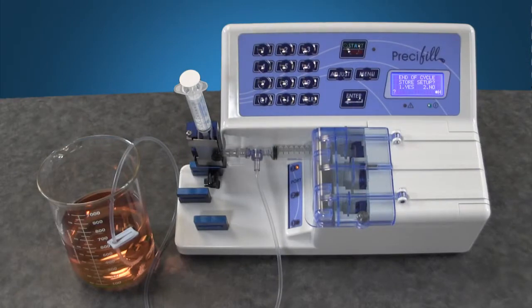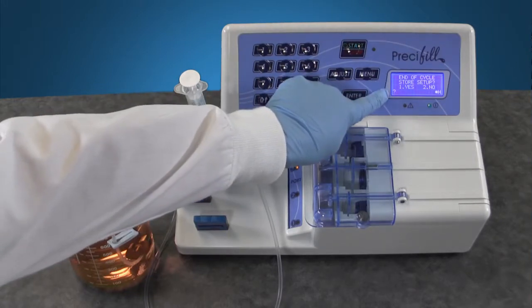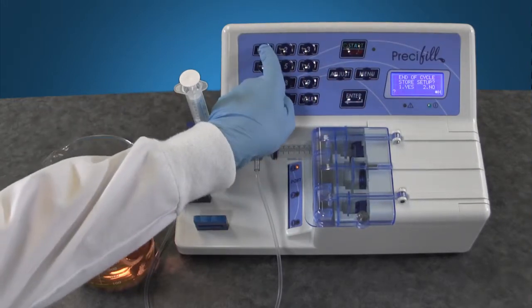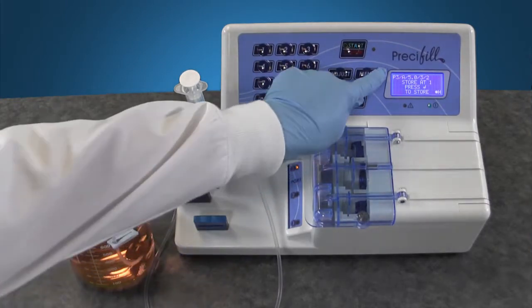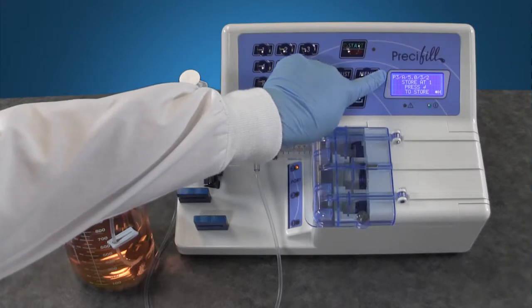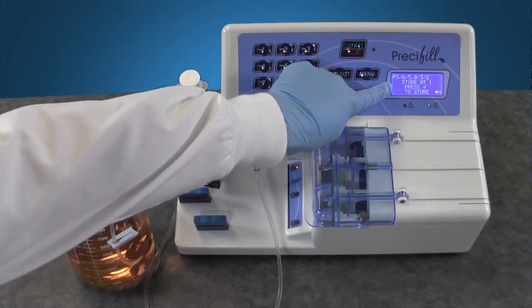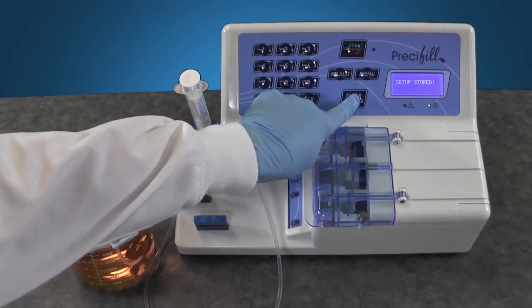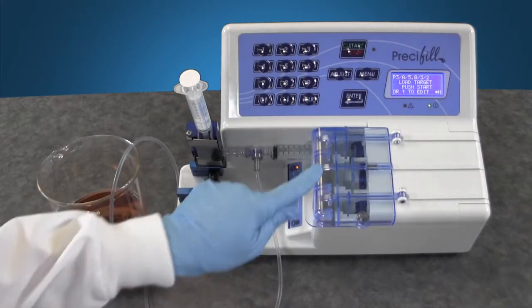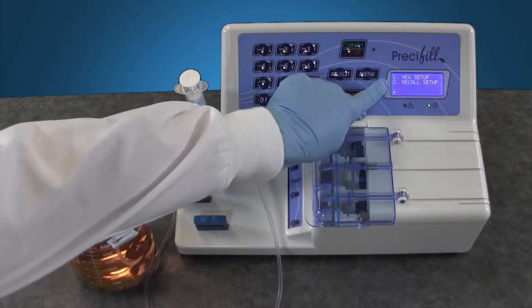Once you complete an automatic cycle fill the programming screen will state store setup. To save this setup press 1 for yes and then enter. The screen now shows the details of the program and which number in recall it was stored as. In this case it is being stored as 1. Press enter to complete the store. You can now access this in future from the main menu screen under option 2 for recall setup.